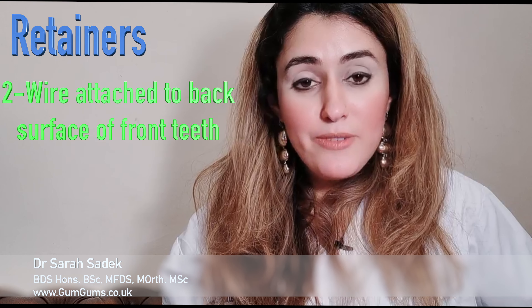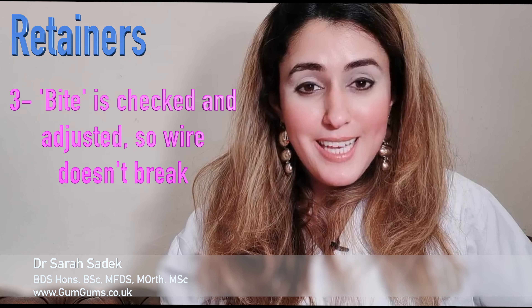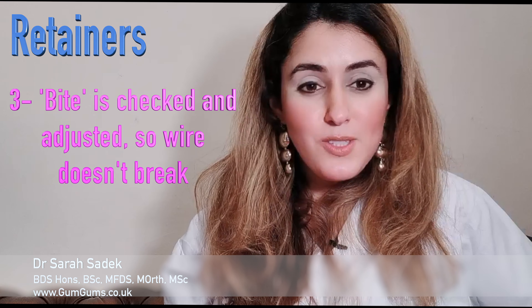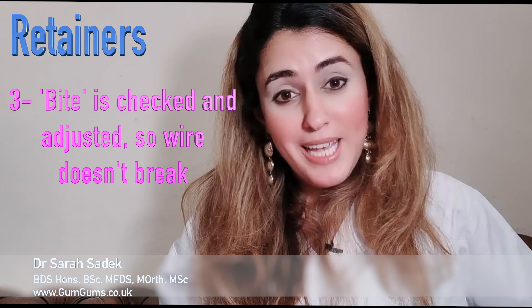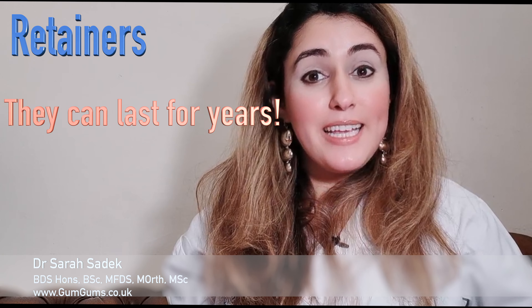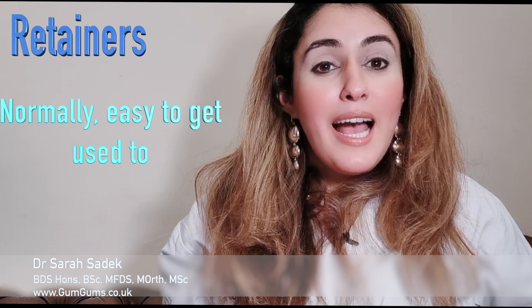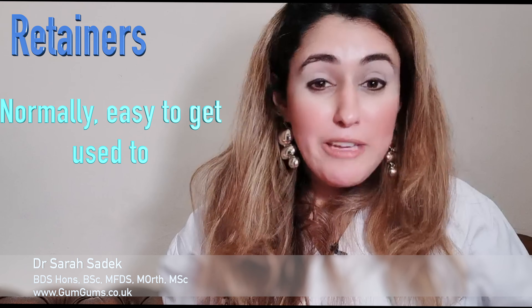The wire is attached to the back of your teeth using a composite material. Your bite will then be checked to make sure you aren't biting into the wire or the composite material, which could cause the fixed retainer to break. The great thing about getting a fixed retainer is that it can be left on for years, and once your mouth gets used to it, which won't take long, you won't even notice it's there.